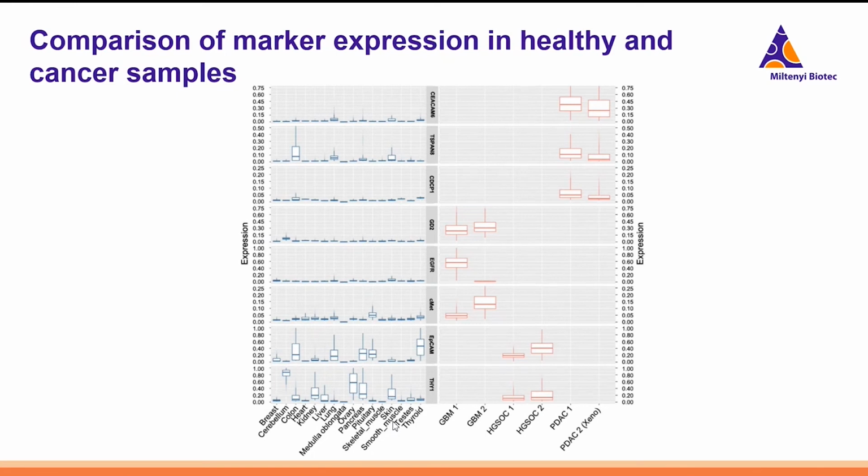So this confirms that some of these selected target candidates are expressed in healthy tissue as well as in cancer tissues. And as I mentioned in the previous slide, the correlation analysis allowed them to identify target pairs as promising CAR T cell therapy candidates. As you observe here, some of the markers were expressed in the tumor tissue as well as in the healthy tissue, and that's why the pair was the solution.